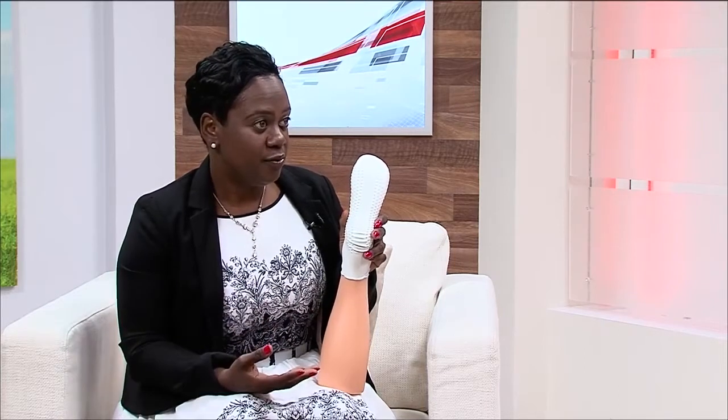Right, so for example, somebody has a knee operation or a hip operation, they are prescribed these stockings for 6 weeks afterwards. Especially the elderly people find them quite difficult to put on. So I'll let you do a demonstration. So this is the sock, and this is the normal sock that they give in the hospital. That's a DVT stocking.